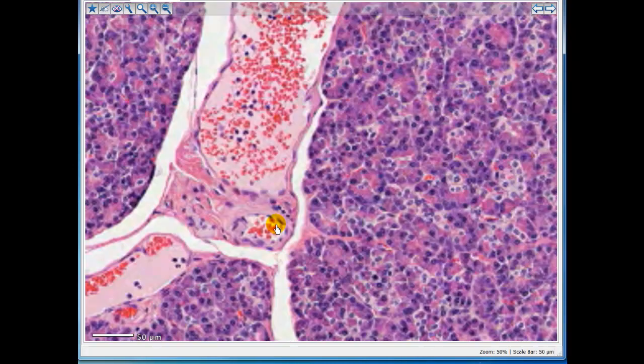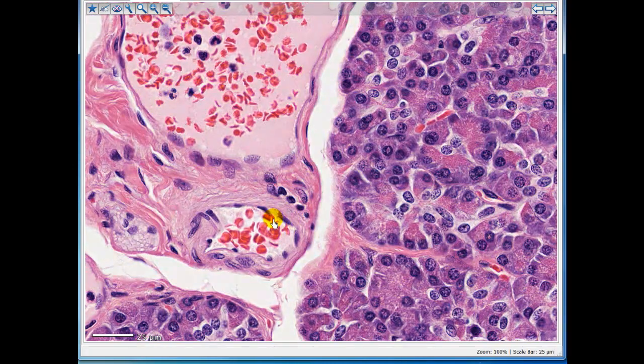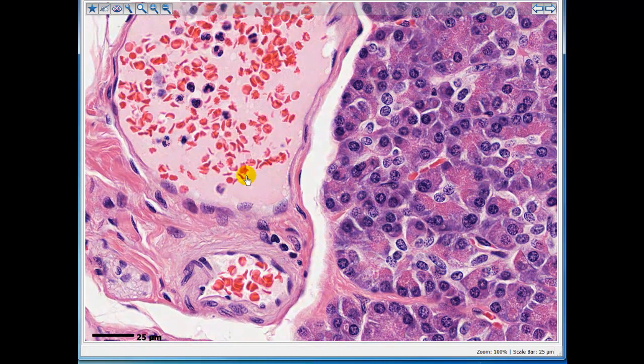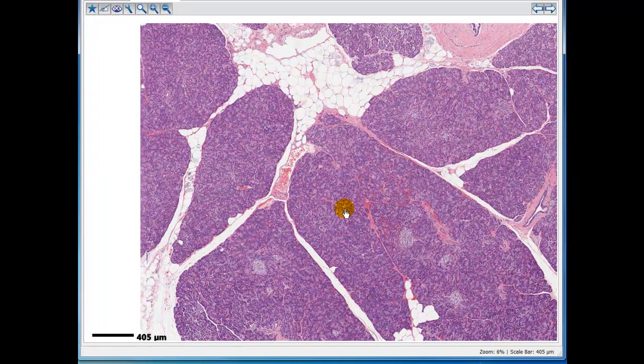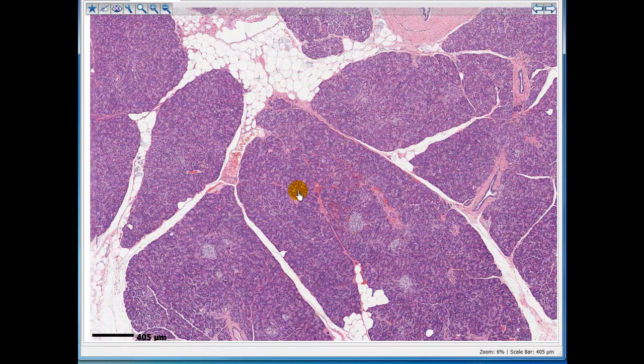And now let's try to find a blood vessel somewhere in here, maybe here. Well, this is a very tiny blood vessel with one layer of smooth muscle around it. And of course, these are red blood cells within the vessel. And here are some white cells that have nuclei. So you see, as an experienced histologist, I can continue and read lots of information in this.